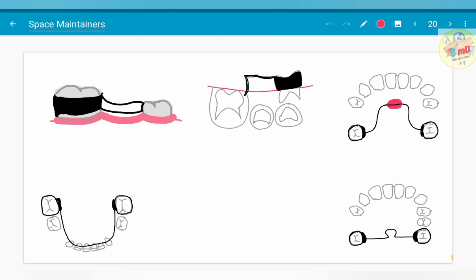Thus, we saw about 5 major fixed space maintainers. The fabrication of the space maintainer and modifications are another huge topic. This video aims to educate you on the 5 basic space maintainers, their limitations, their advantages and indications.